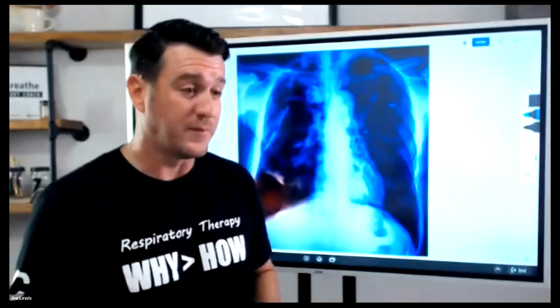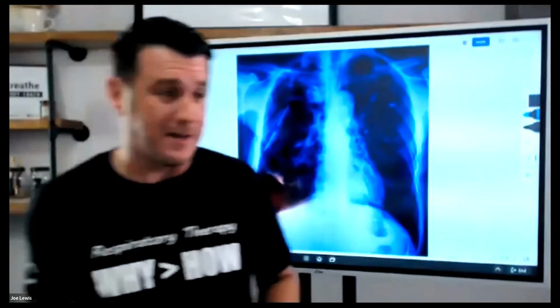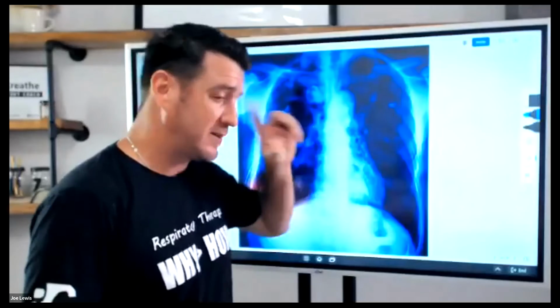And that is where you take driving pressure. Here we go again with driving pressure, right? I'm telling you, it's the future. We've got to start talking more about driving pressure. Driving pressure times 4 plus your respiratory rate is an even bigger indicator of outcomes associated with mechanical ventilation. Excuse me, talking a lot here. So that's barotrauma. Okay, so keep that in mind.